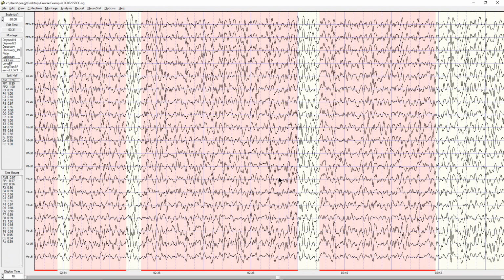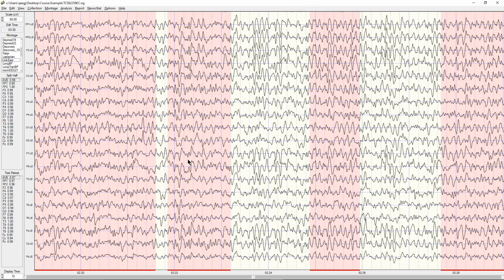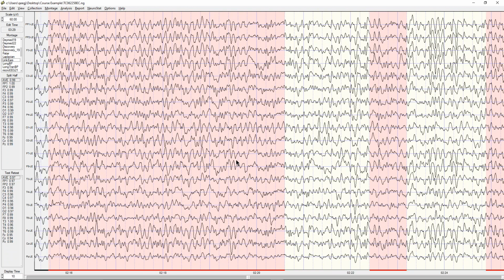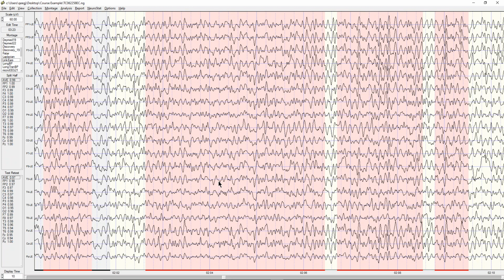That's not good. That's not good. So every time you do an assessment, you have to go through and visually inspect. Otherwise, if you were ending up... So I got rid of that because of all these artifacts in here.